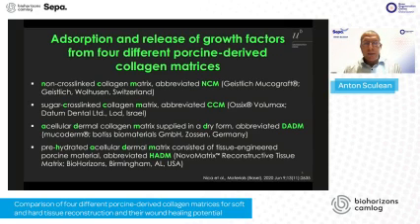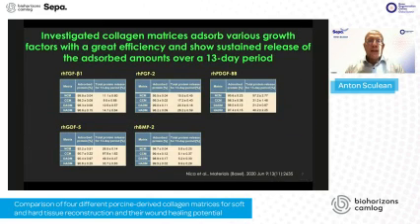And quite recently, we also have a novel so-called prehydrated acellular dermal matrix that consists of tissue-engineered porcine material. In our studies, we abbreviated it as HADM.